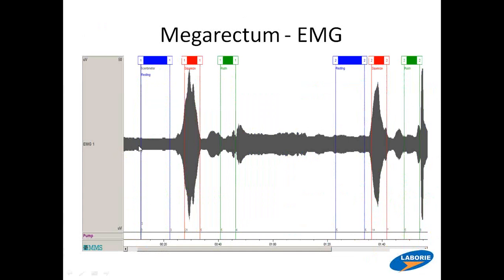So her EMG was basically normal with a resting voltage. This is 4, and a good squeeze, and then a 5 on the push. I did defecography on her. It is so thin because the rectum was so big. I filled, instead of 120, I filled 4 syringes, which is 240 cc's of the barium contrast with mashed potatoes. She formed a little rectocele, but when she stopped straining, it reduced. She strained appropriately, and ultimately the anal canal opened 2 centimeters, and nearly all of the contents were emptied. So I said, okay, well, let's see how you do.